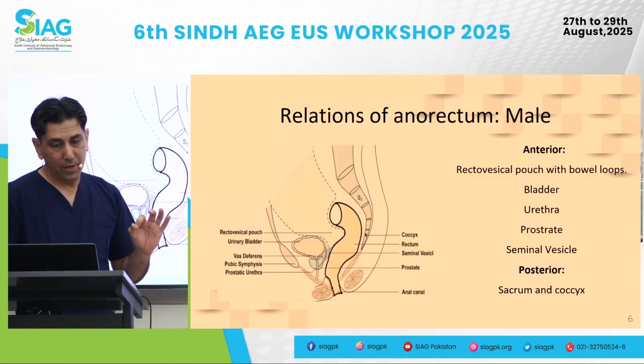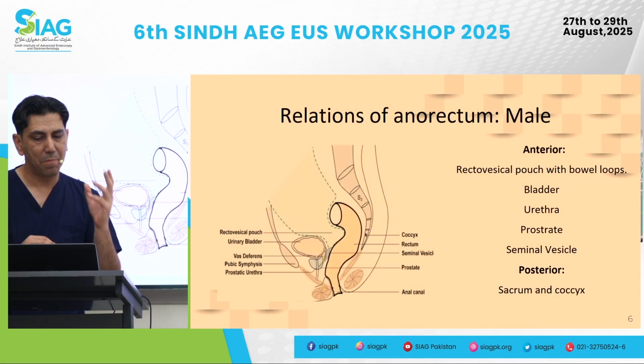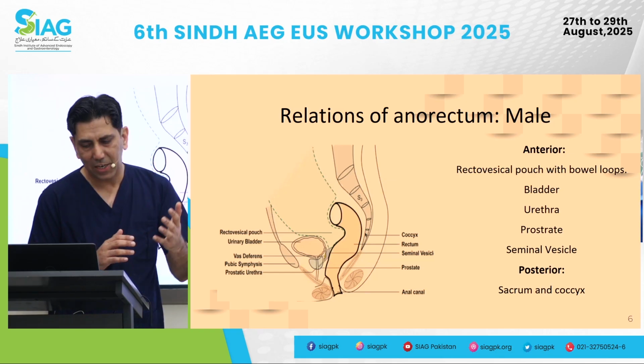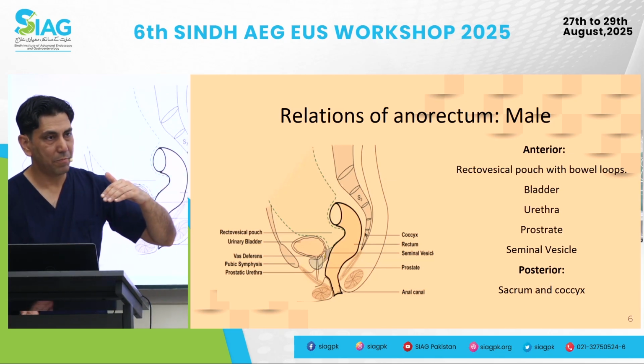Okay, then it's also important who you're actually scoping. Is it a male patient? Is it a female patient? Because in the male you may have to orient it slightly differently, in terms of what organs are anterior and what organs are posterior.